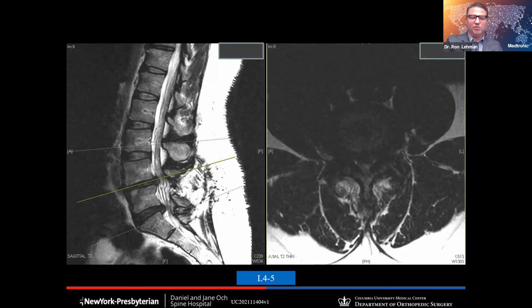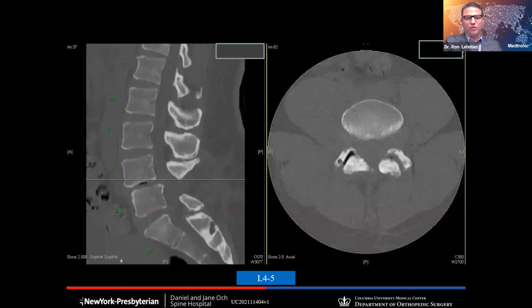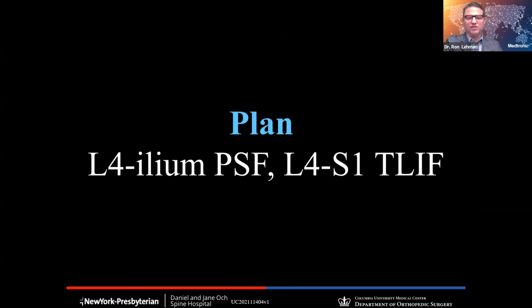And so is this a neurogenic problem? Is it a structural problem, or is it both? And probably in this case, I would hazard to say that it really is both. We get a pre-op CT scan, which actually shows improvement of that kyphosis, but it's still kyphotic at 4-5, but has vacuum disc phenomenon, which we know is a good case for the utilization of interbody to make sure that we can get this patient to fuse. In addition, has subchondral cysts, air in the facet joints. This patient's very debilitated by this condition, using everything they can to do it.